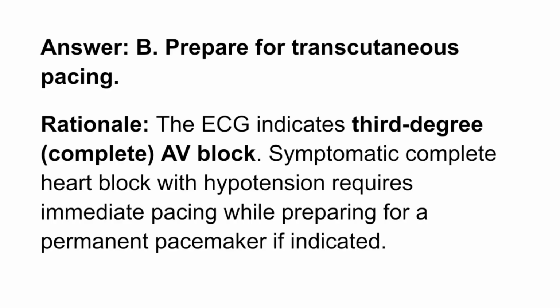Rationale. The ECG indicates third-degree, complete, AV block. Symptomatic complete heart block with hypotension requires immediate pacing while preparing for a permanent pacemaker, if indicated.